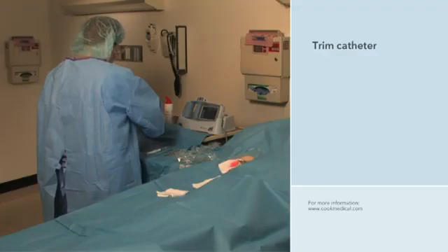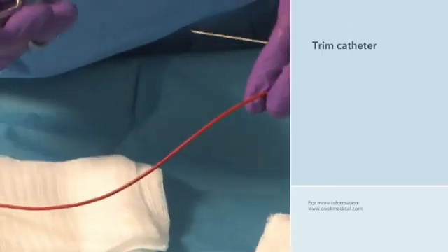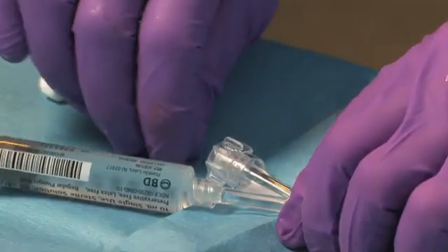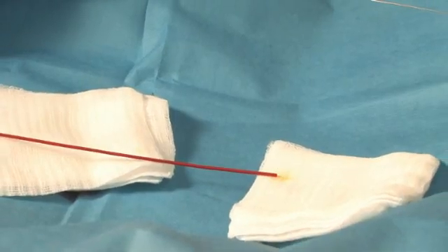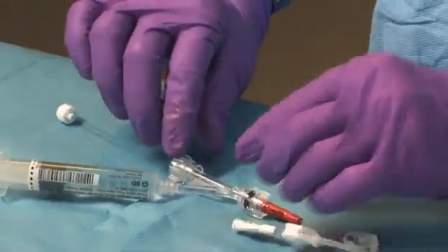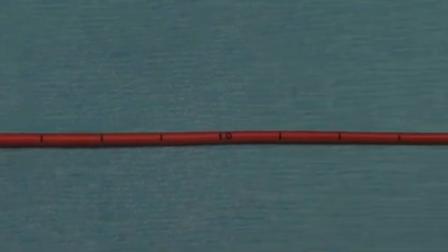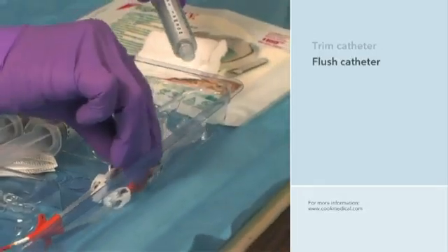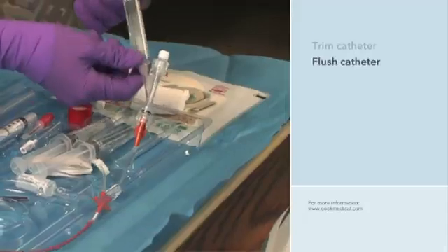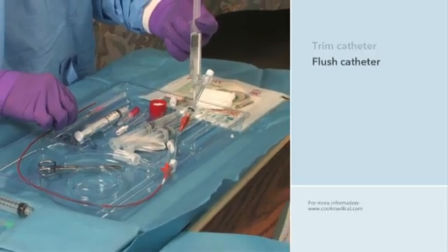The introducer is now ready to facilitate the catheter's entry into the vein. Using the measurements taken earlier, the clinician trims the catheter to the proper length using scissors or scalpel. She pulls back the obturator to ensure it is not cut during trimming and makes sure each lumen is patent and not pinched closed. The precise trimmed length ensures the tip will reach the superior vena cava. The clinician flushes the catheter with sterile saline solution, flushing enough to thoroughly moisten the obturator surface, which activates the hydrophilic coating, making the obturator very lubricious and easily able to slide in or out of the catheter.